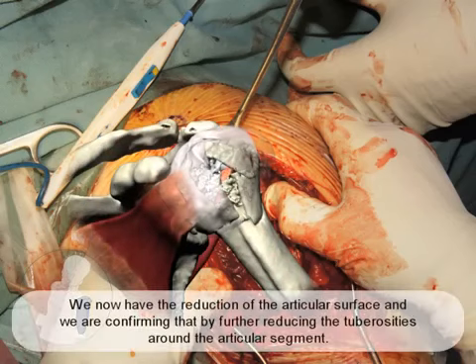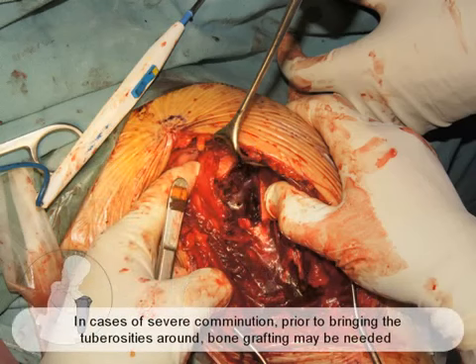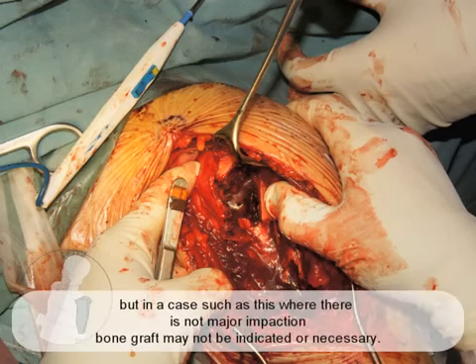And we see here we now have the reduction of articular surface, and we're confirming that by further reducing tuberosities around the articular segment. In cases of severe comminution, prior to bringing the tuberosities around, bone grafting may be needed, but in a case such as this, where all the fragments are there, there's not major impaction, bone graft may not be indicated or necessary.